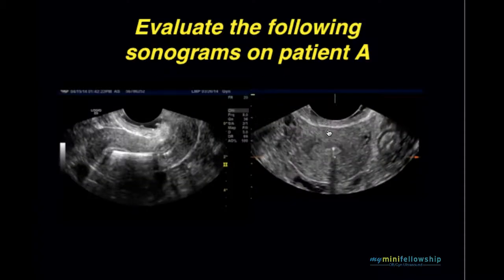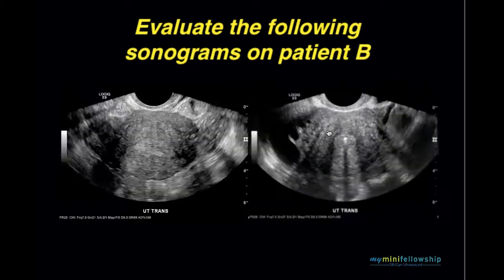Now, I'd like you to evaluate this patient who had a missing string. The main body of the IUD looks well seated in the endometrial canal. On the transverse image, I would say the same thing, although we can't see the wings. Why are you concerned about that? Well, I'm not necessarily concerned, except to say that they could be malpositioned. We're just not seeing them yet. All right. So, very good.